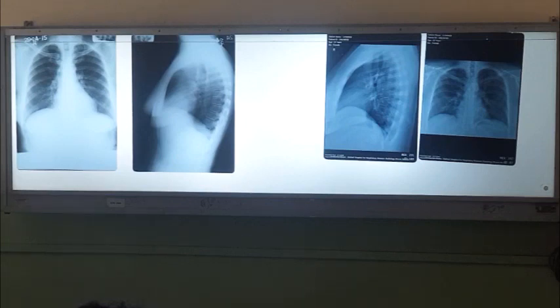And then even if the X-ray is normal, you get the patient to preserve these X-rays, keep them, right? Later on, they are going to help you, right? So we have a lot of TB patients. At the end of the treatment, we do a chest X-ray and ask them to keep it. So the next time when they come with symptoms, to look for reactivation or to look for some other pathology arising there, you have to have the previous X-ray. You have to keep those two and compare. So all the X-rays are very important. Ask them to keep them, right?